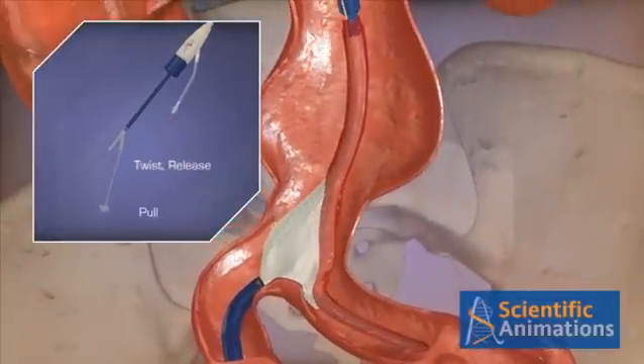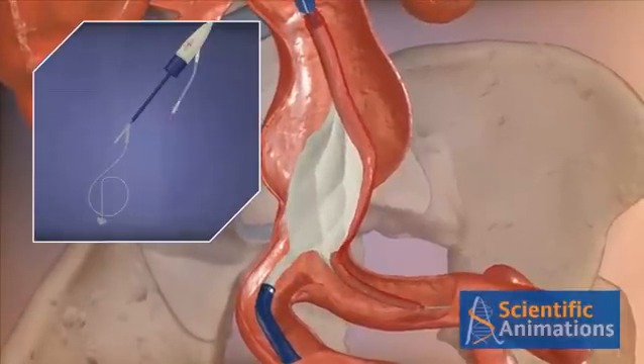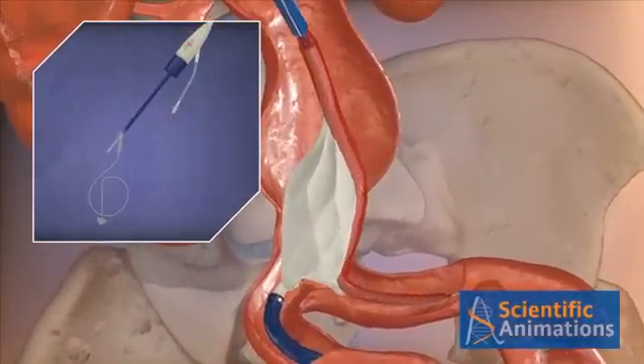To deploy the main body, twist, release, and pull the control cord handle. You can stop at any point to reposition the graft if necessary.